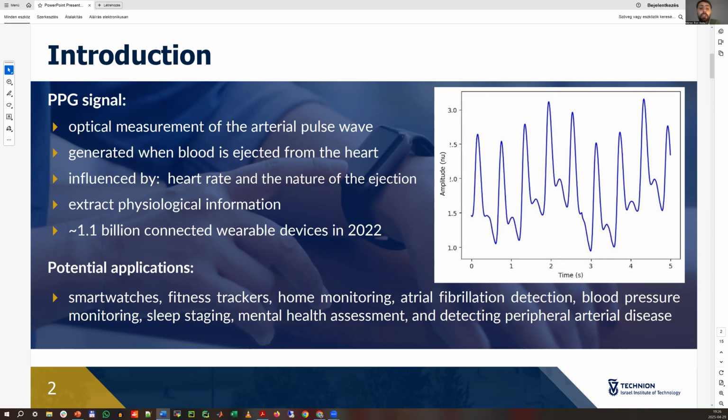One of the challenges was to make a high performance PPG detector. Previously, Peter Charlton benchmarked the top PPG detectors, and we found that the Aboy implementation was very strong, but it was not that fast.